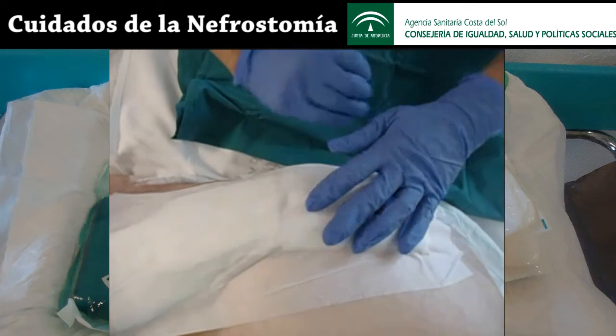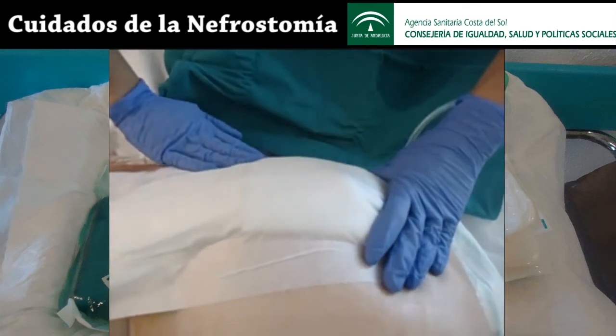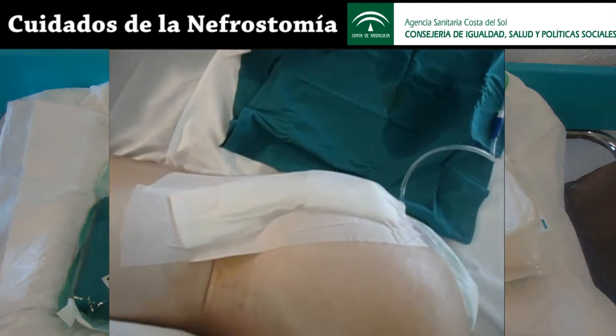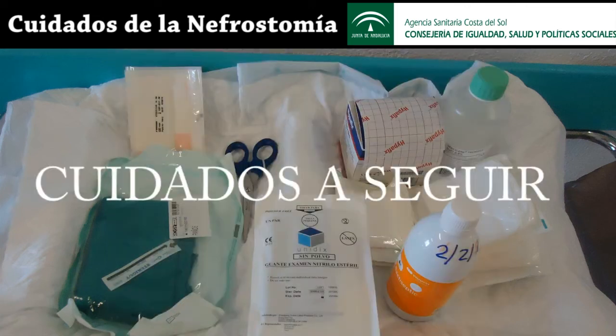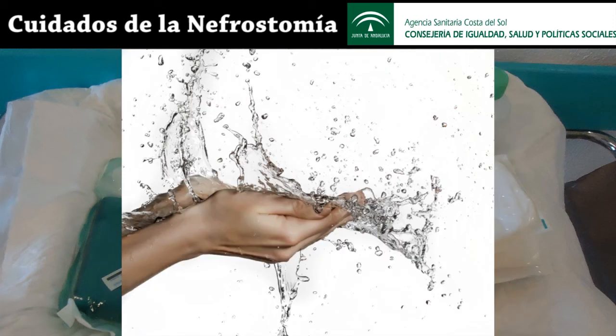Nephrostomy care procedure is performed every 48 hours during the hospitalisation. Once the patient is sent home, nephrostomy care is performed every 72 hours at the health centre. Nephrostomy tube home care instructions. Hygiene. Drink plenty of fluids unless contraindicated. Always wash your hands before any manipulation.